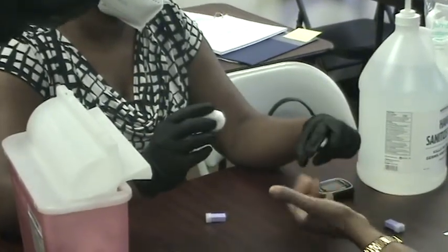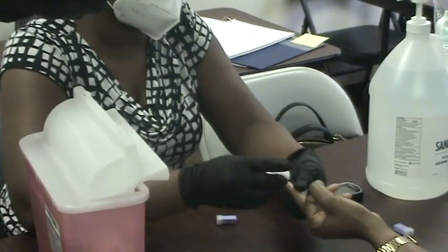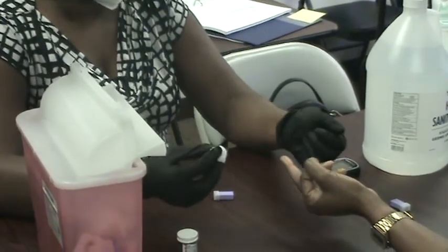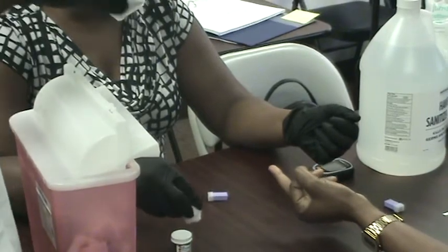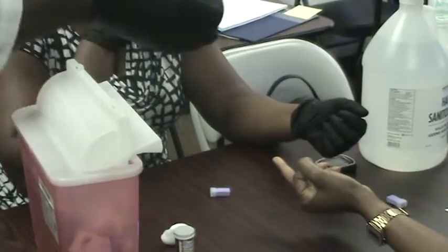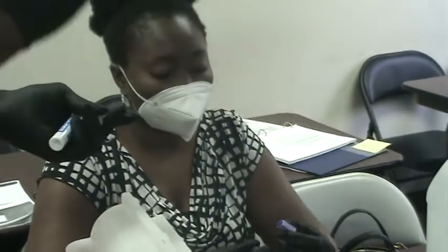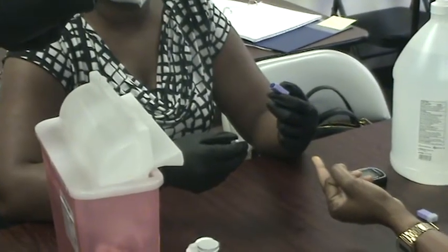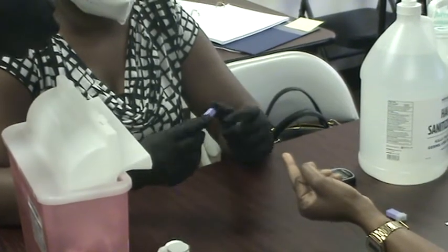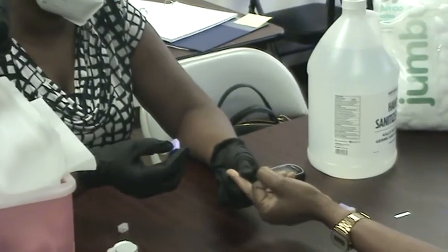It's better to use like a tip. Yeah, the middle finger is fine. There we go. It's done. Then the way this needle works, when you open it, you're gonna hold it in hand. Don't just press until there's a click. Press gently down. Okay, just press here. No, just press. Yeah, okay, press.